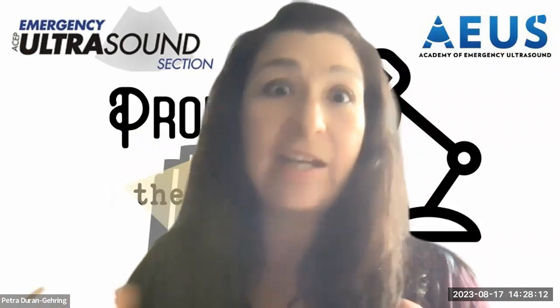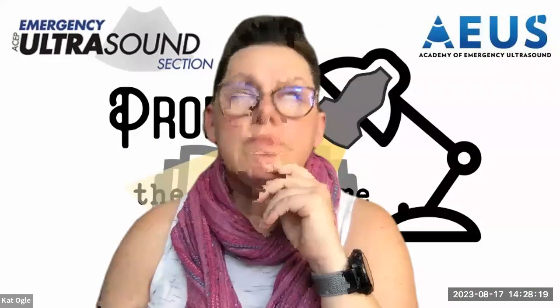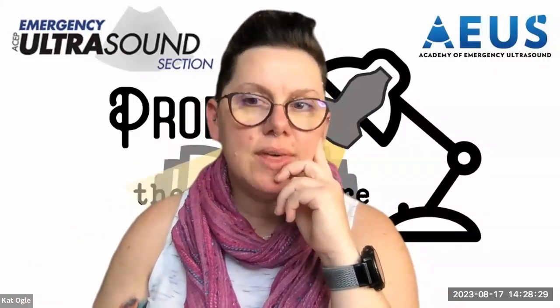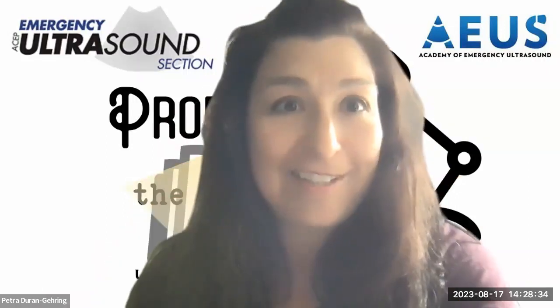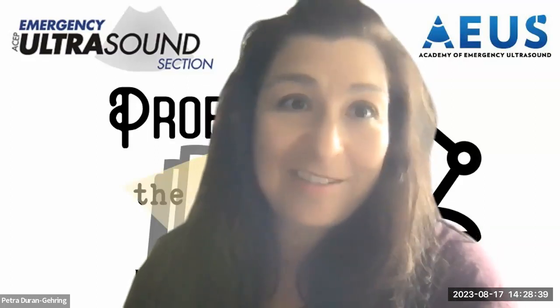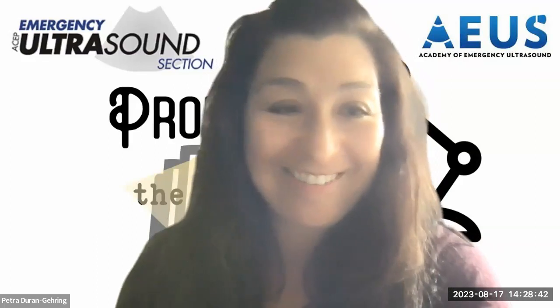So the question is, when you guys were doing this, was it just the resident who called out the exam, what the diagnosis was, positive or negative, or do you also have an attending who looks over their shoulder? Yeah, for our trauma activations, there's either an EM attending in the room or a surgery attending in the room. So they are looking over the shoulder of the resident as they're doing the exam. Any difference in the discrepancy between the two different types of attendings? It's always a question.